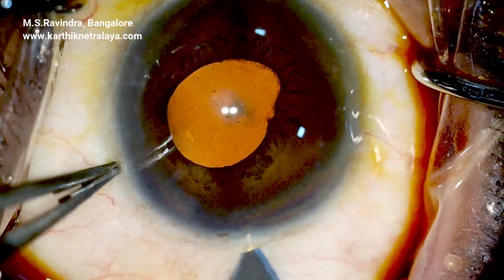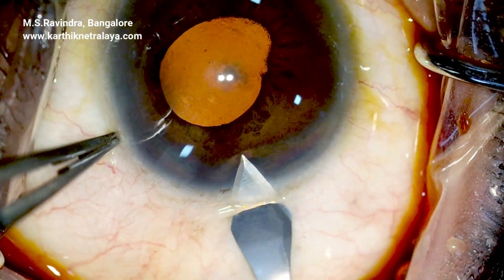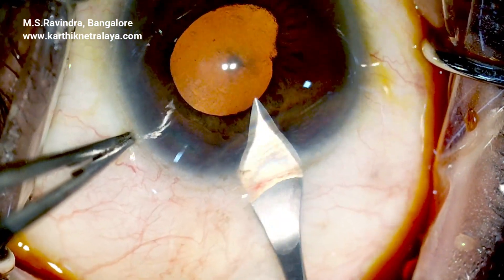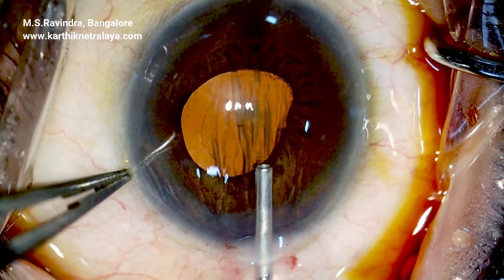The eye has posterior synechiae due to recurrent uveitis, with an extremely shallow anterior chamber and a non-dilating pupil.